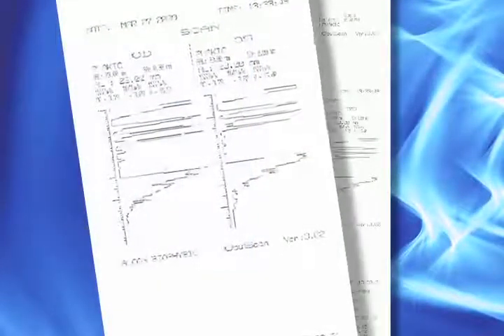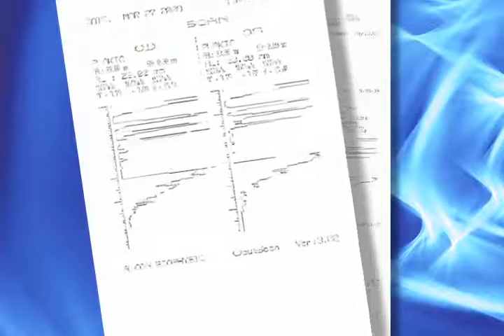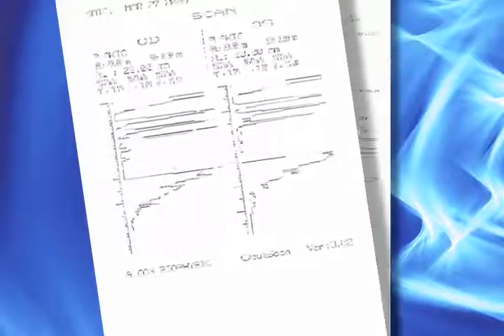The second means of measuring the length of your eye is something called immersion A-scan ultrasound. This uses ultrasonic energy to measure the length of your eye. What you're looking at now is a printout of this particular test. Again, you see lots of numbers and squiggles, and again, this helps me determine just how accurate this test is, and I can check one against the other for improved accuracy on the length of your eye.